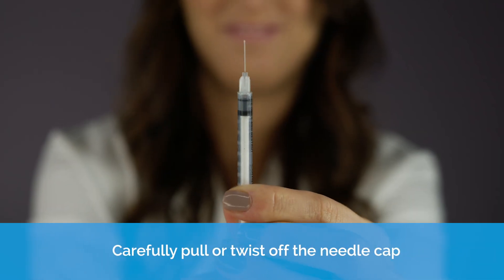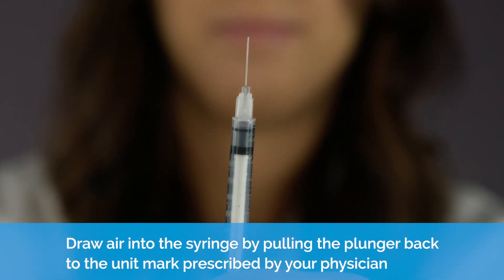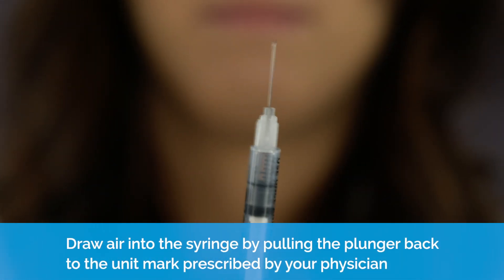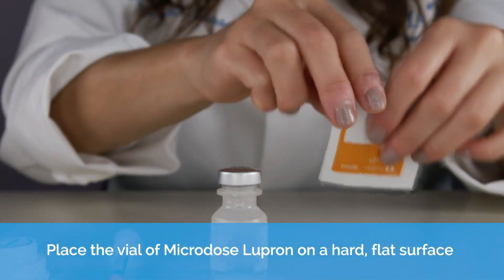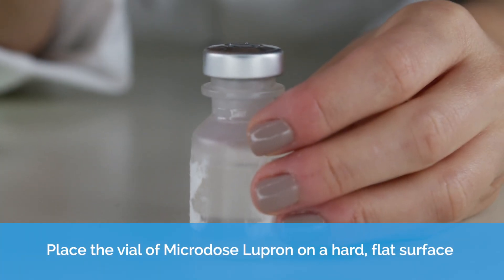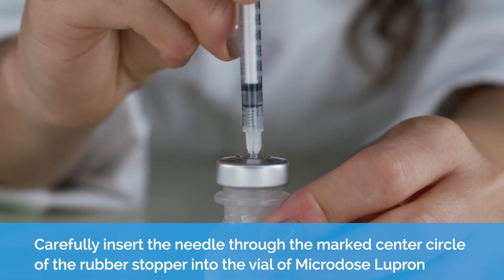Carefully pull or twist off the needle cap. Draw air into the syringe by pulling the plunger back to the unit marked prescribed by your physician. Place the vial on a hard, flat surface. Carefully insert the needle through the marked center circle of the rubber stopper into the vial.